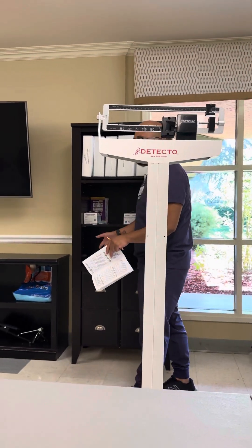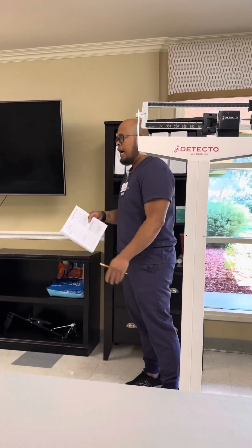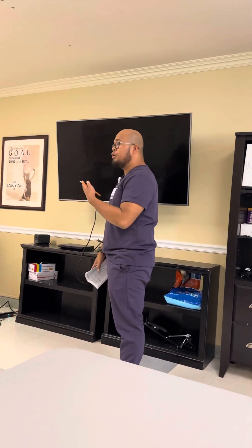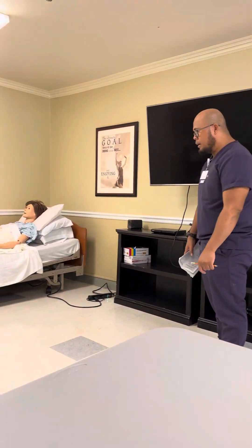Of course, you ask the patient, can I come in? The patient says yes, after you wash your hands. Hi, my name is Rusty. I'll be your nurse today. Today I'll be helping you with your weighing assignment.